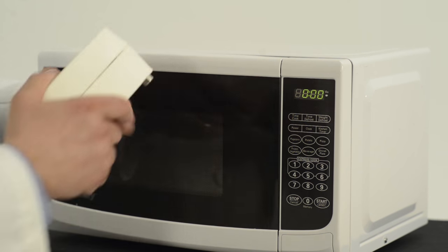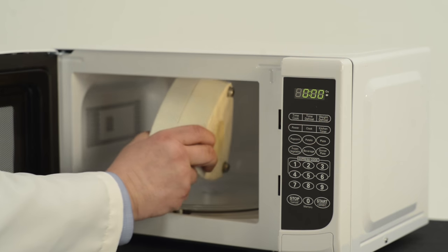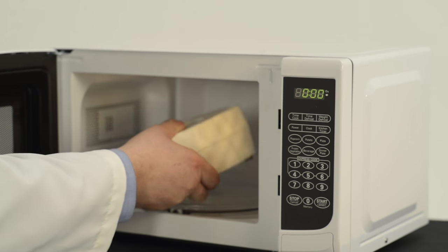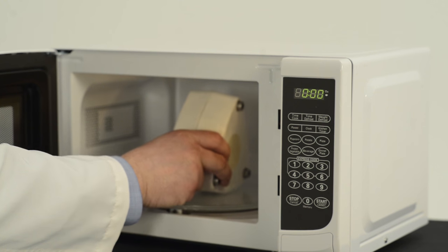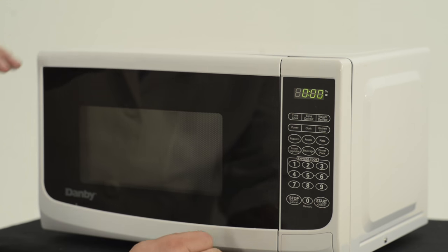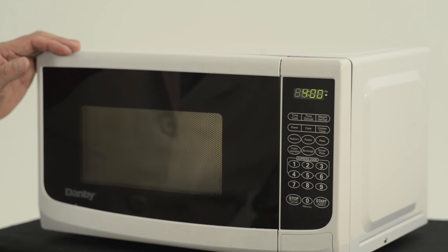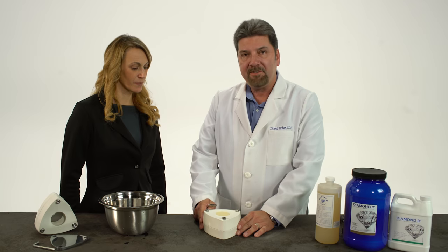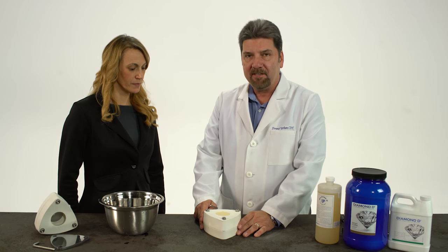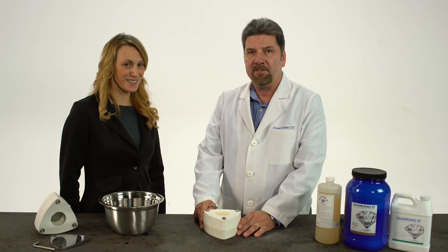Now we're ready to place the flask in the microwave oven. We want to stand it up like this, as opposed to laying it down, because we get a more thorough cure that way. So right in the middle of the turntable — we close it. We're going to cure this for four minutes. The denture has been cured for four minutes in the microwave oven. We cooled it on the bench for 20 minutes, and we put it in cold water for another 10 minutes. So now we're ready to de-flask the denture.